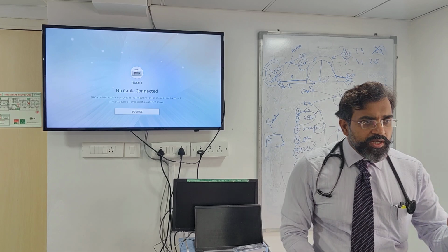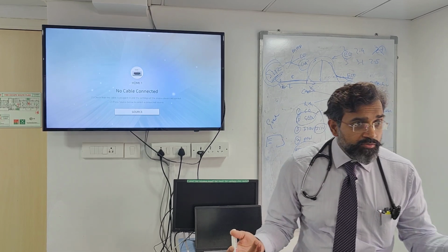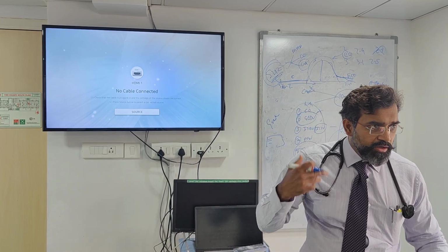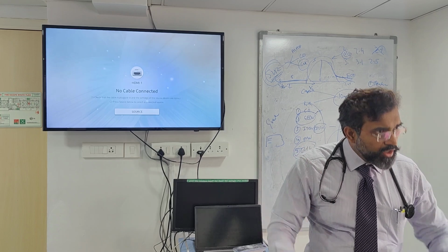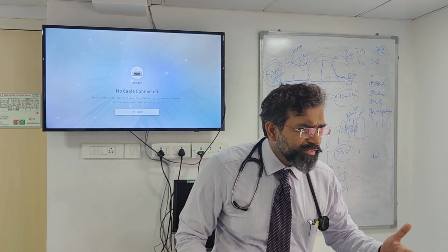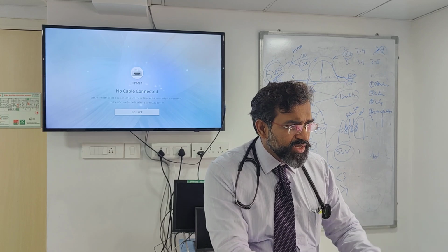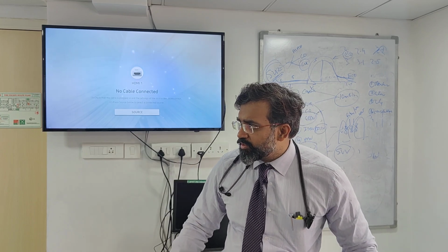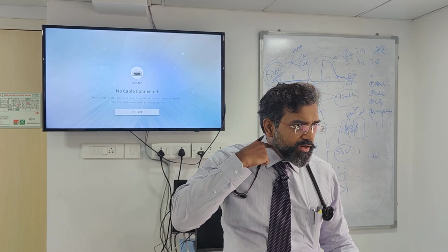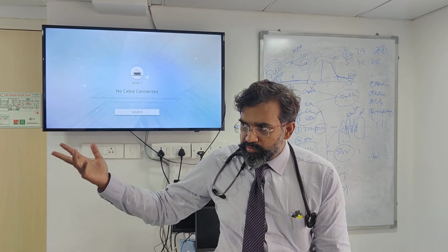Similarly, what happens when there is a CRRT circuit? Provided you are not putting the dialysis line in the middle of your circuit, between the injectant port and the thermistor, you can still do thermodilution in a patient on CRRT. You are just looking at temperature decay. Even if the temperature in the CRRT circuit is reduced, say to 36 degrees, I just want to find my decay.